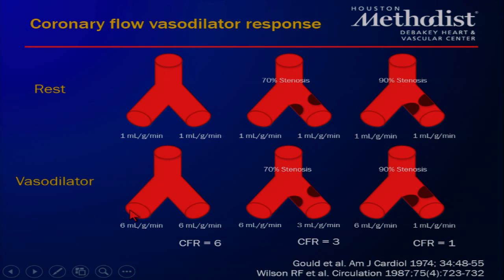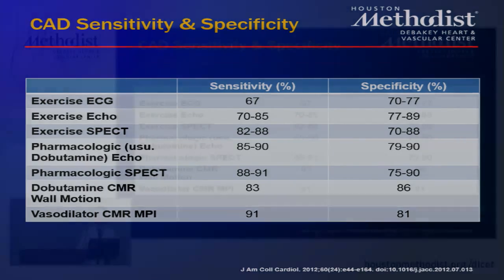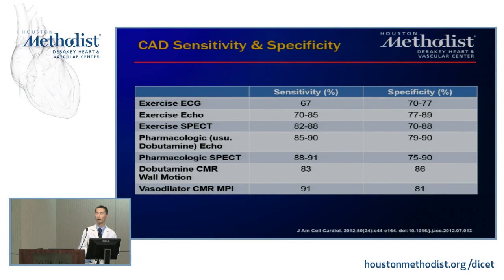Once we apply vasodilator, we increase the overall coronary dilatory response and the amount of coronary blood flow. In a patient who has stenosis, the amount of blood flow that is able to pass through is limited, so we get a relative perfusion decrease, shown in these two bottom cases here. I hope that makes sense, because that's the premise of looking for regional differences in coronary blood perfusion, hence regional wall differences, with different stress tests like myocardial perfusion imaging in nuclear and CMR.